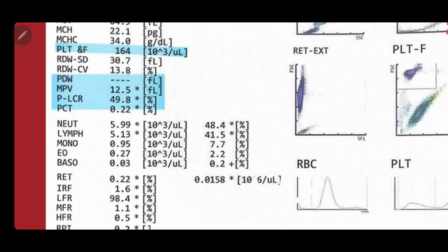For white blood cells, if we break them down into neutrophils, lymphocytes, monocytes, eosinophils, and basophils, we see that the neutrophil count is still below 10,000 cells. This means there is no inflammation in the body. For lymphocytes, the normal range is 2 to 5. Although this case is slightly high, it can be interpreted in two ways: either an acute infection or the animal has a habit of licking and chewing. This helps differentiate the animal's behavior.